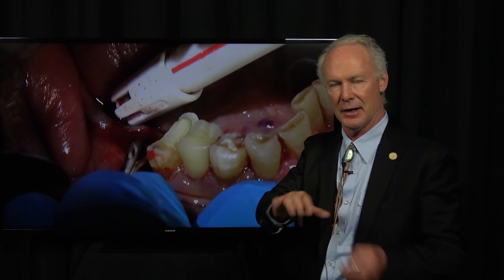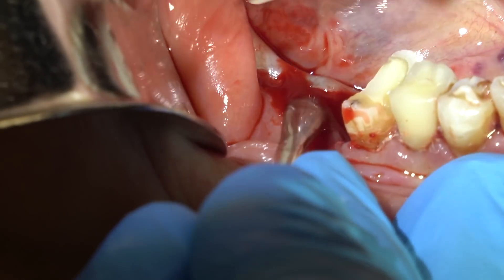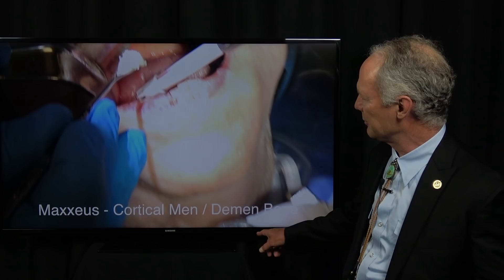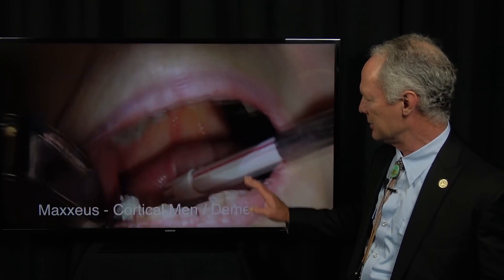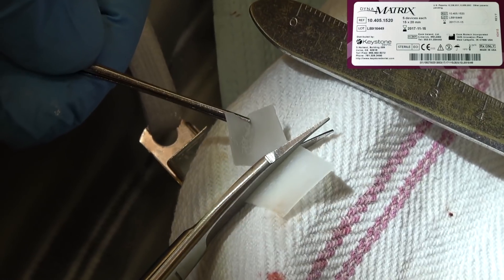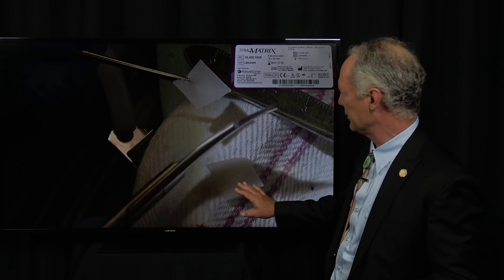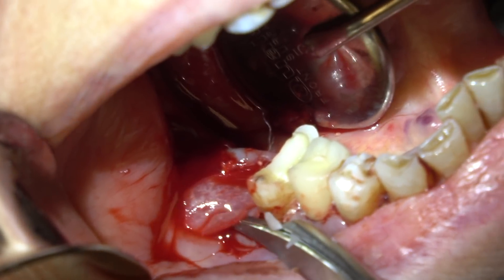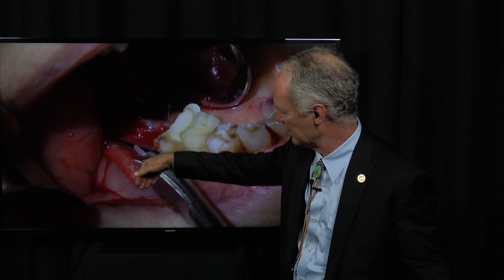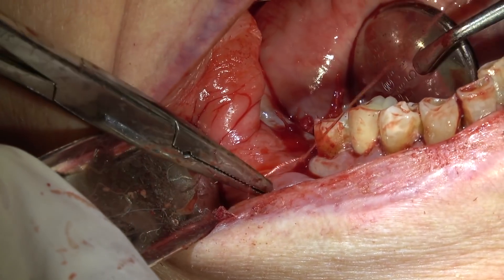This is Maxius cortical mineralized demineralized bone — I really like the composition of this bone graft. I'm going to plug it with a plugger, just an amalgam plugger. Then this is Dynamatrix, a resorbable collagen membrane. I'm going to use that to cover the bone graft, tuck it under the lingual flap and the facial flap. Then I'm going to suture it with 3-0 gut suture.